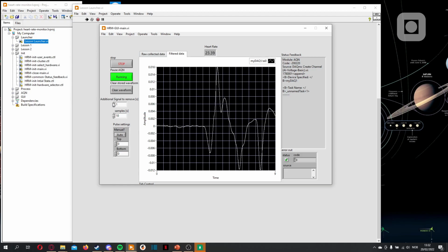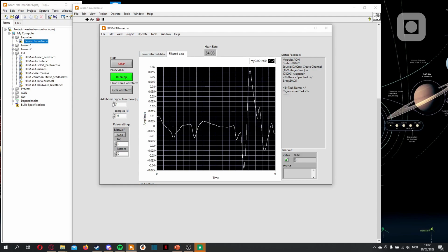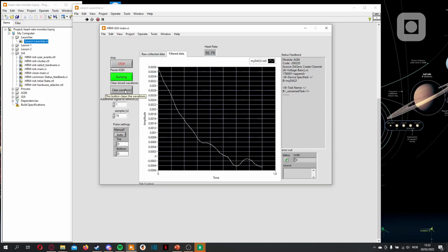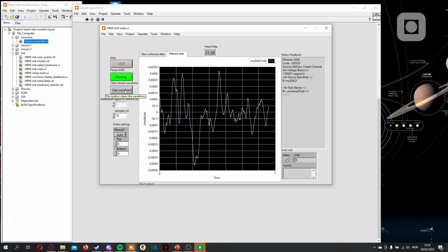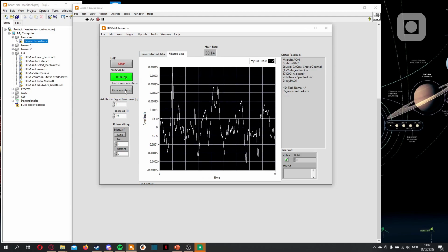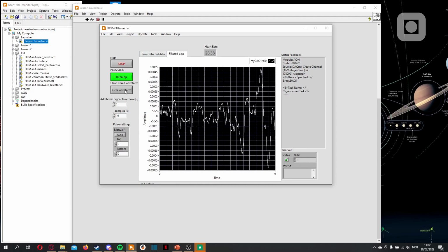As I hope everyone remembers, this is quite a sensitive thing. We try to keep the hardware as simple as possible, which of course makes it more complex or sensitive, you could say, less idiot proof. Like your smartwatch is pretty idiot proof, but that's a lot more hardware and a completely different way of measuring your pulse. Still see there's a problem here, but the problem is really my light source.